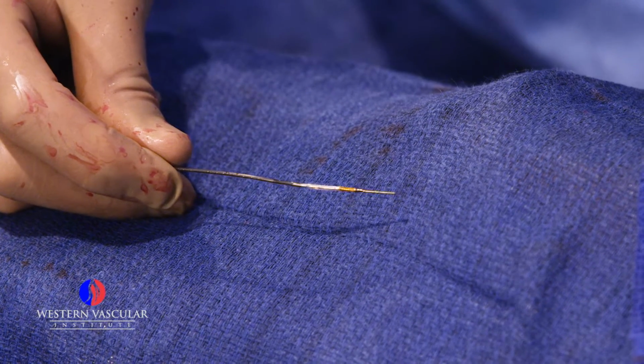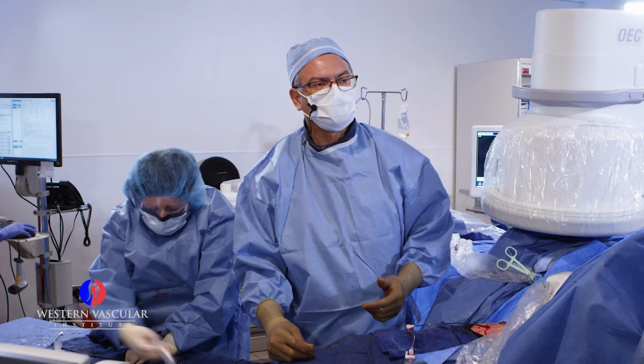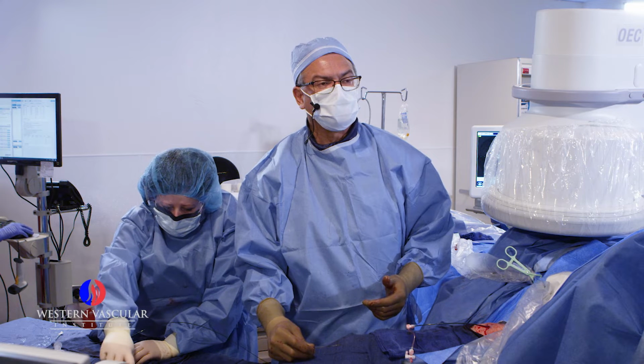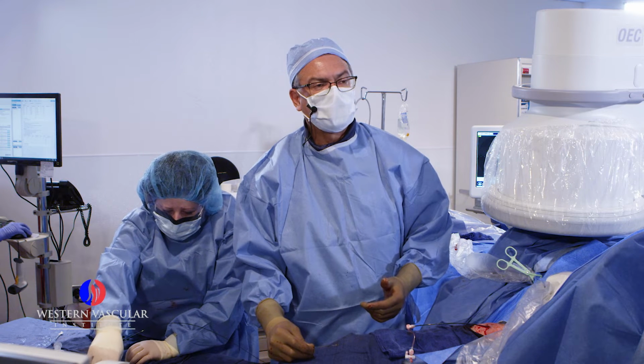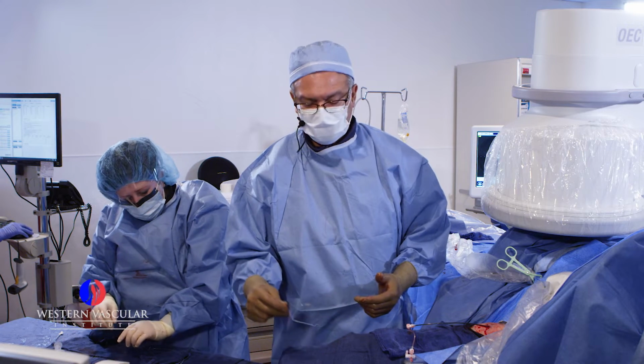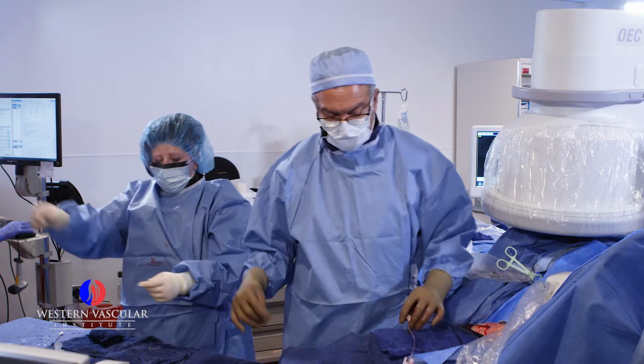It gives you such a detail that you can identify plaque versus thrombus, and also can give you the dimensions of the artery. We can measure how big the artery is, how long the blockage is, and it just gives you the characteristics of the problem that you're looking at. So we're going to introduce that in a tiny wire.